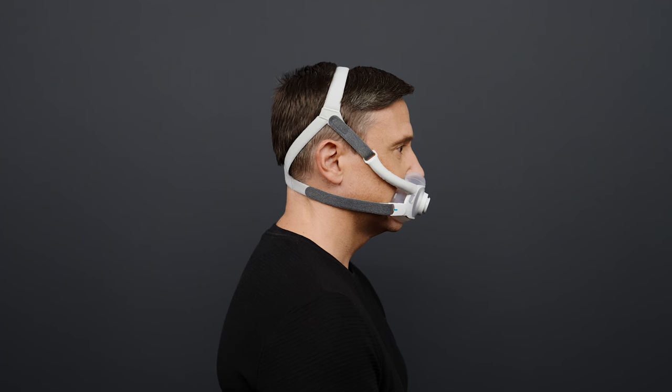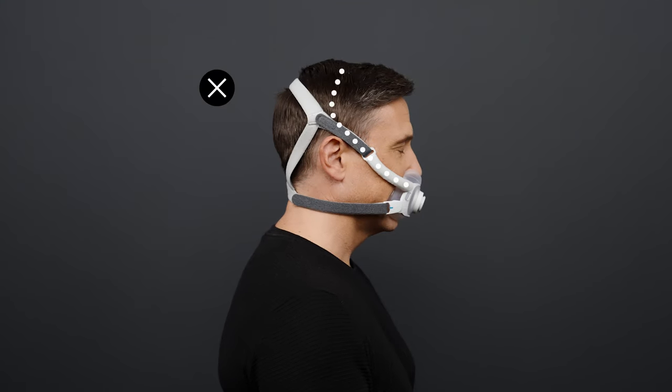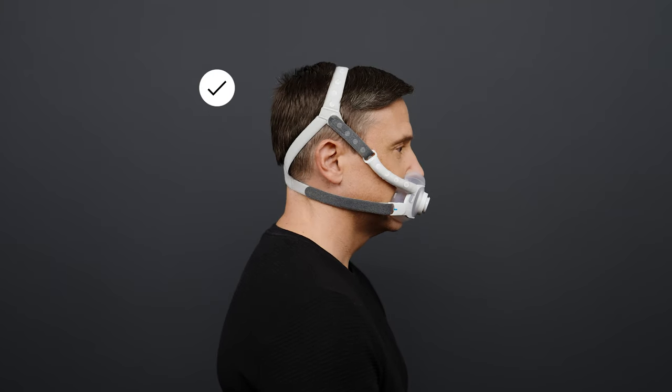The top headgear strap should sit on top of your head and not too far forward or back. Bring the lower headgear straps forward under your ears and attach the magnetic clips to the frame.